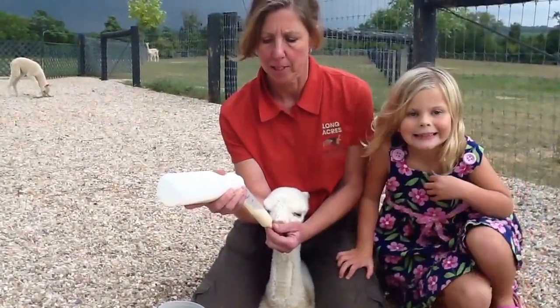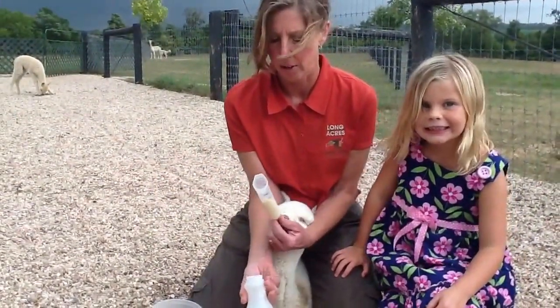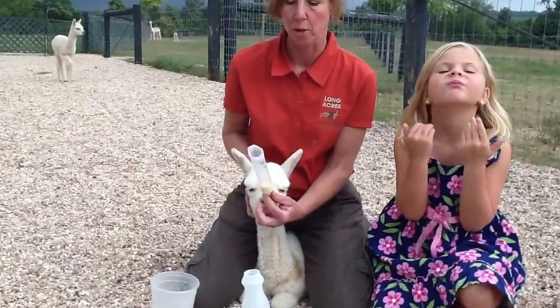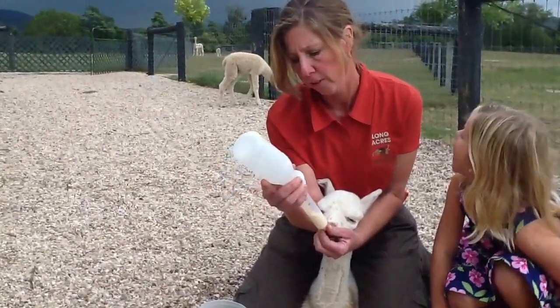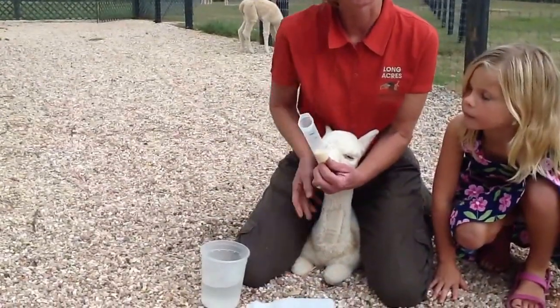If you were to put this in and you've got a lot of air back, you would know that you were actually in the lungs. If you go down the wrong place, like the trachea, they really will start coughing even before you put any liquid down. So if you're unsure where you are, you could always put a little water down first, because water's not really going to get you into any trouble.